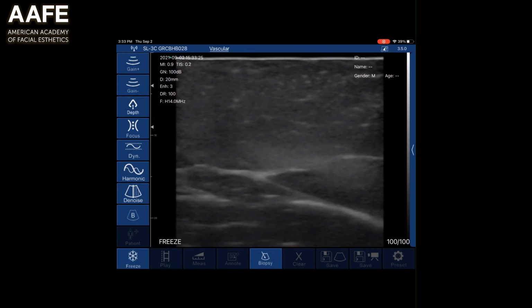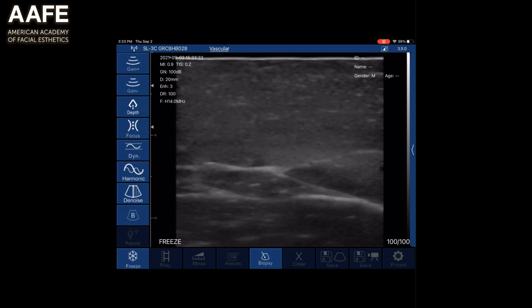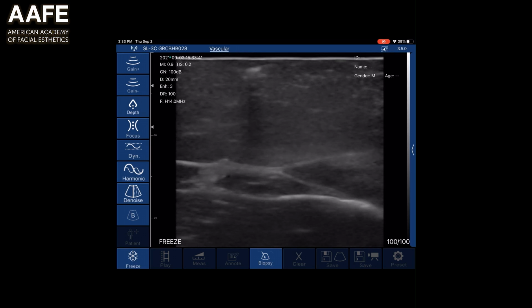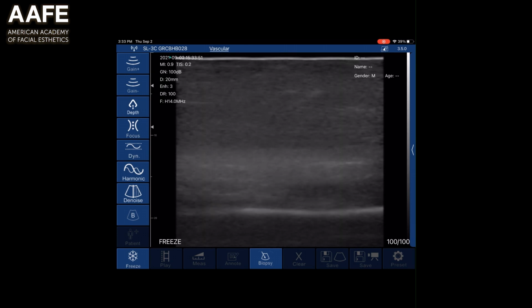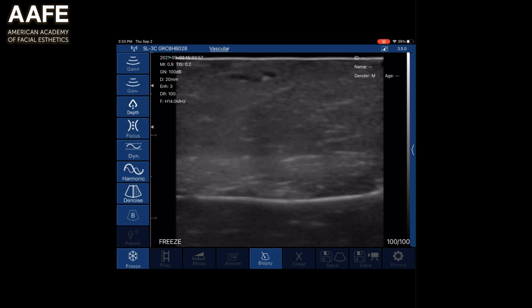Ultrasound guided injections. That is what makes ultrasound so fantastic here. And here's a little experiment that we went ahead and did just on a chicken breast. It is great to practice on if you want to practice ultrasound guided injections here. Here you see a needle starting to pierce through right at the top of your screen here. And you are going to see that we are going to inject filler into this area, as you will see this happen. Here you see that needle track through right there.